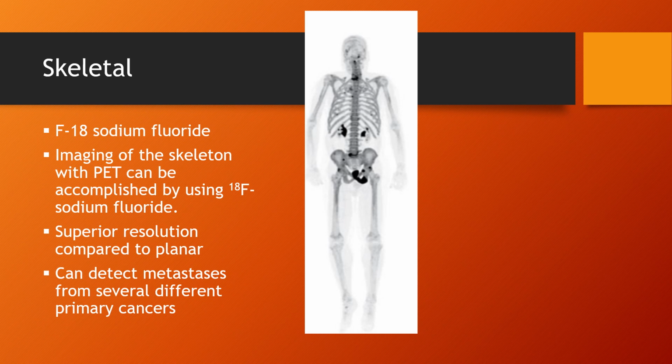And there is a 1.2 centimeter rounded sclerotic region in the anterior column of the left acetabulum. See that down here. Sites of fluoride activity are visualized elsewhere in the skeleton, localized to degenerative changes on co-acquired CT scan. So really nothing that specific.